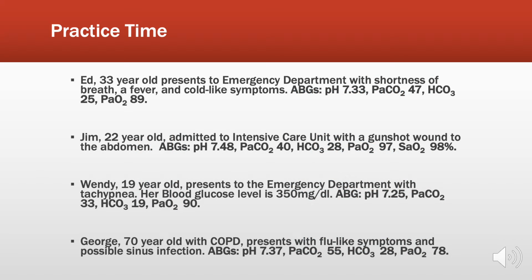I've found over the years that the very best way to really make this work is to do case studies. So we're going to just take 4 of them and run through them quickly. Ed is 33 years old. He presents to the emergency department and he's short of breath. He's got a fever and cold-like symptoms.